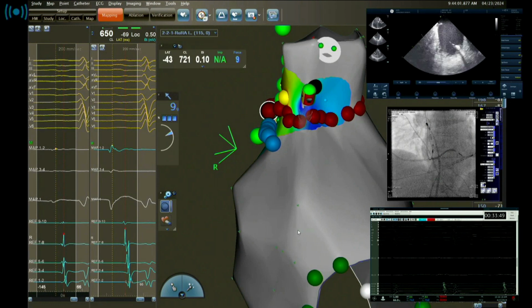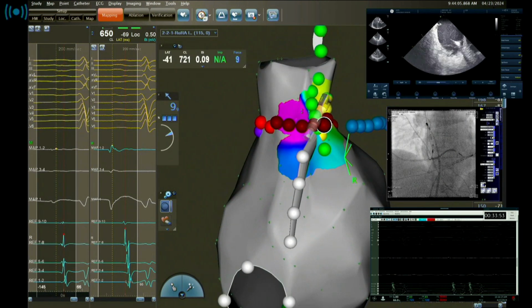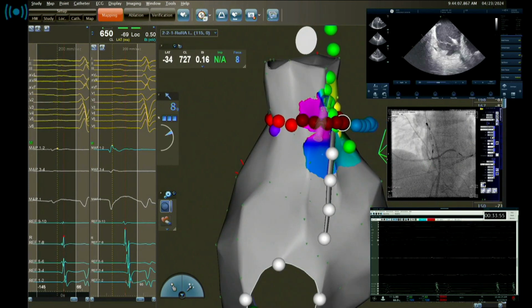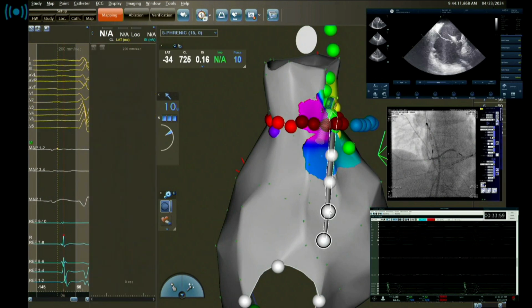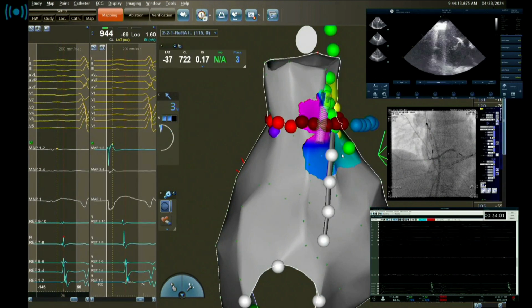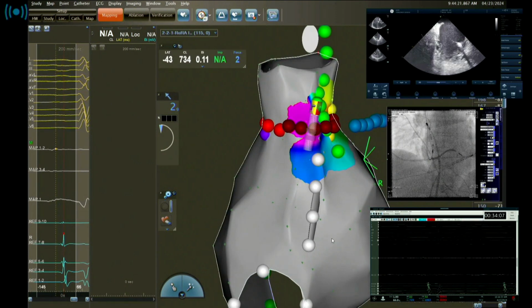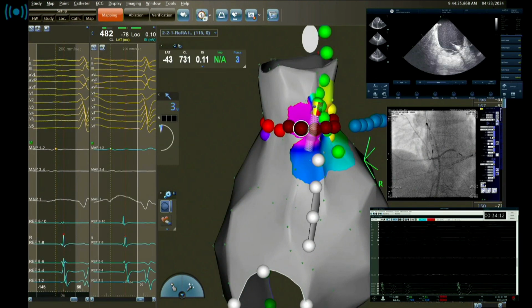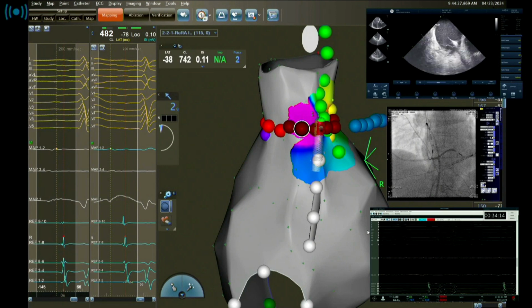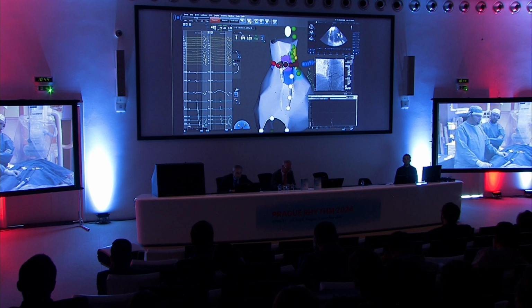And now we will continue. Our frequency is now 83, so it goes down and down all the time, even if the Isuprel rate is all the time the same, 3 micrograms per minute. And we will continue ablation with these intercaval lines. And I think we may switch to the other room for CNA, and we will comment later on what more we did. Yeah.